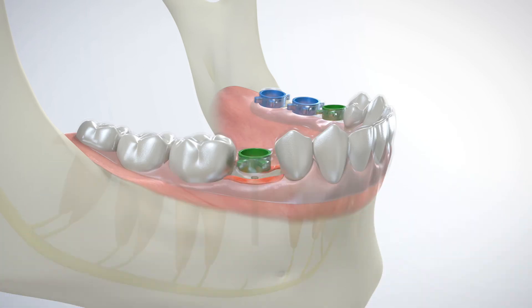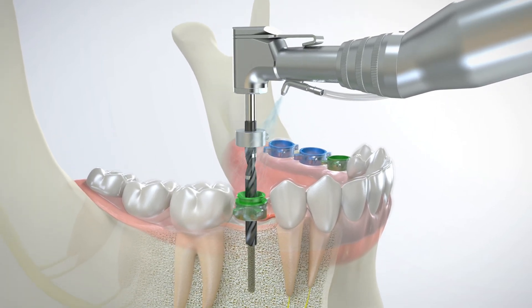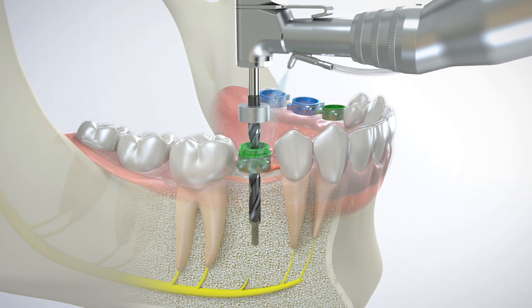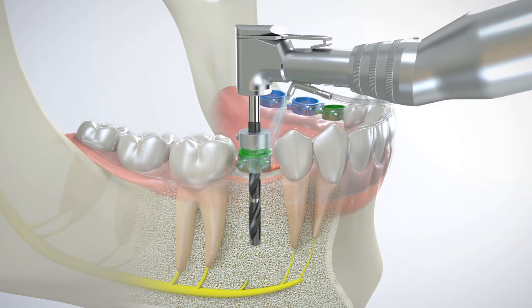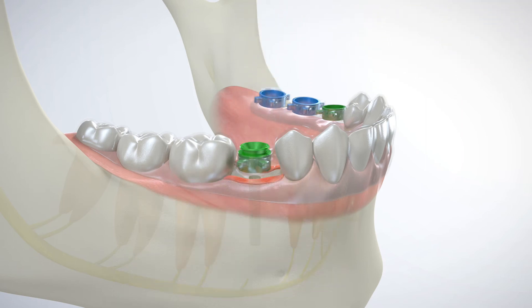The drill sleeve is then snapped into the surgical guide and the IR tool simply separates from the drill sleeve using a sliding motion. A surgical drill fitted with a preset GRS drill stop is precisely guided by the GRS surgical drill sleeve at the planned angle and orientation. A bicuspid may require a sequence of three specific drills while a molar may require a completely different sequence of four or more surgical drills.